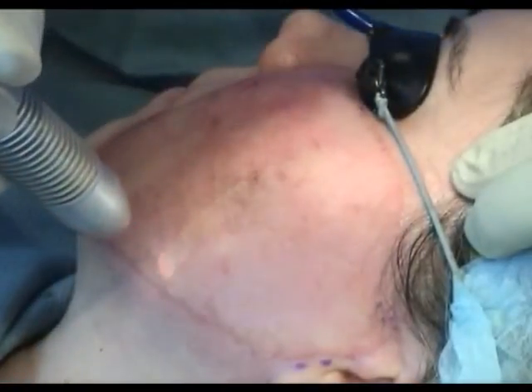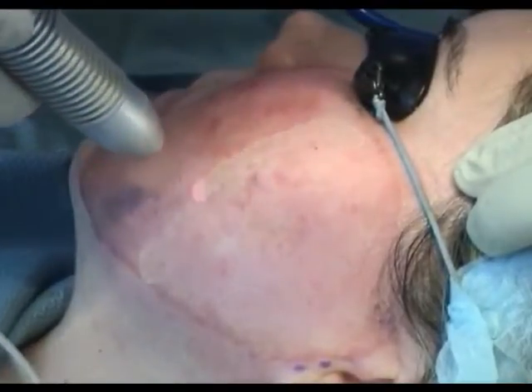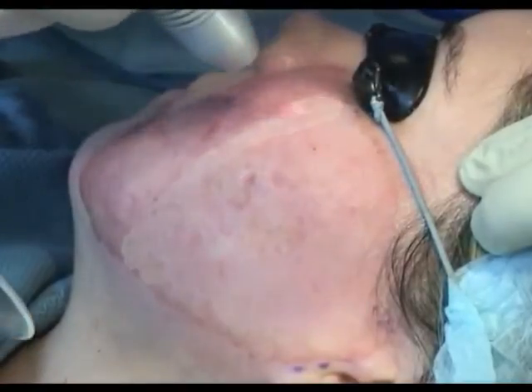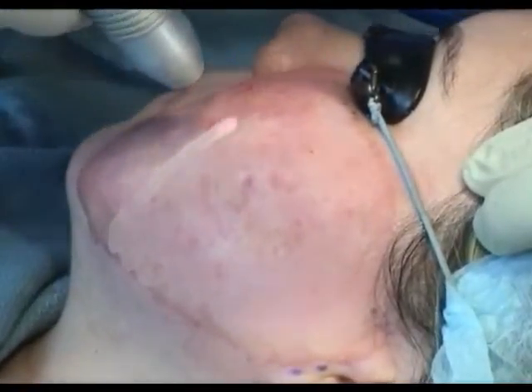The final pass is performed again with the erbium YAG laser. Here, the 7mm spot size was used with a setting of 5 joules per centimeter squared. This pass is designed to remove some of the thermal damage created by the pass with the carbon dioxide laser.